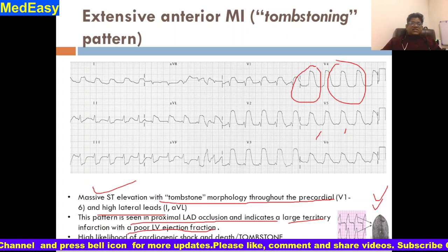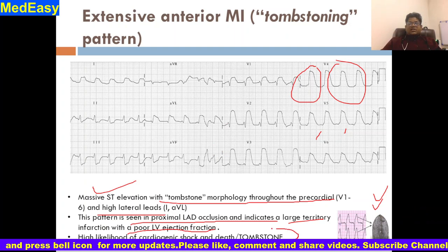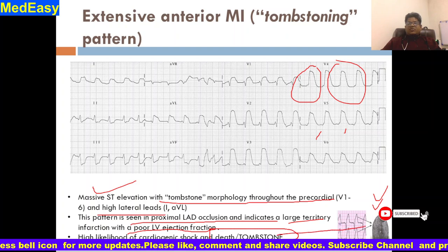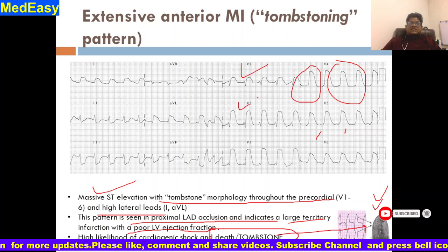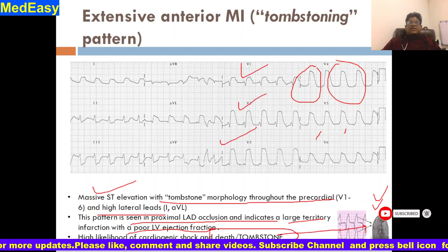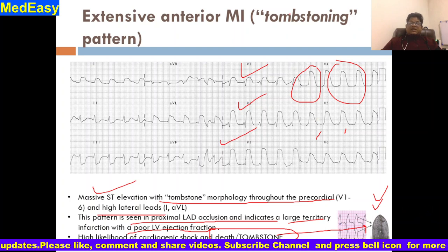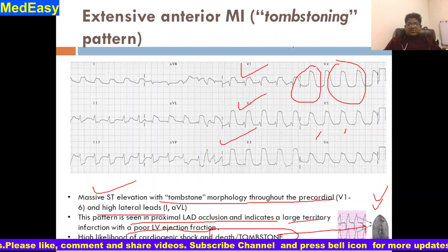There is a high likelihood of cardiogenic shock and death with the tombstone pattern. Always remember — never miss this ECG. This represents a very, very serious condition with a very extensive myocardial infarction.